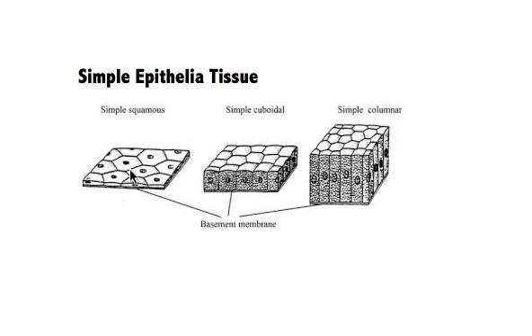Okay, so we're going to look at the next one, the cuboidal. As their name suggests, they're cube-shaped with a spherical nucleus, so an almost circular-like nucleus. They often line ducts and tubes and can allow material to pass through them in a similar way to the squamous epithelial. They often occur in the glandular tissues, making secretion.